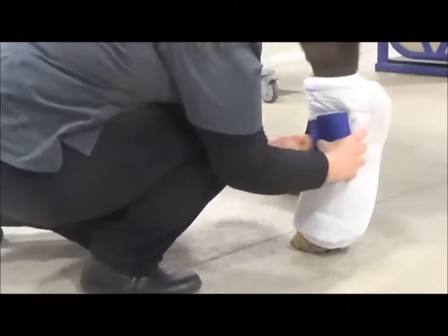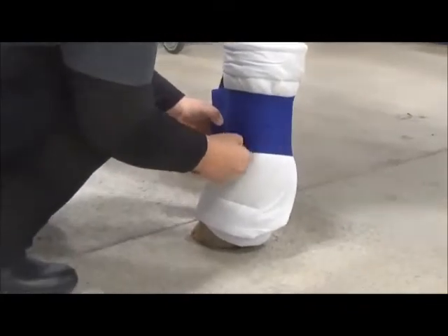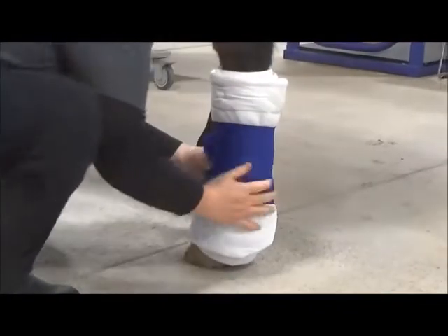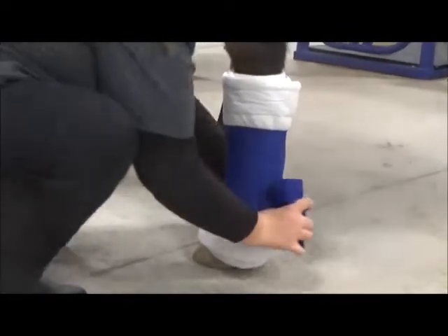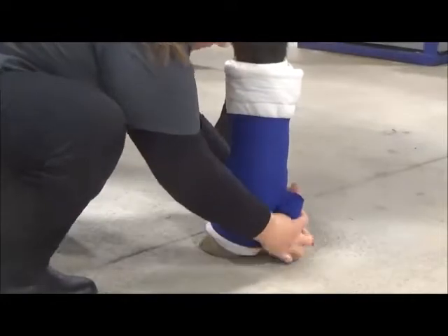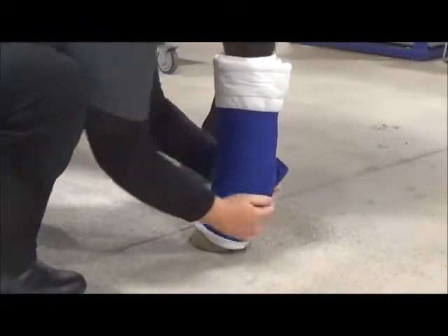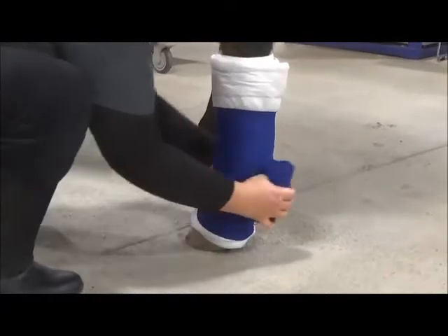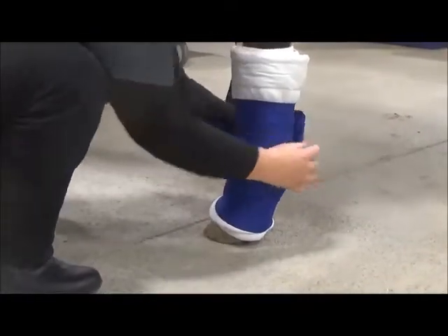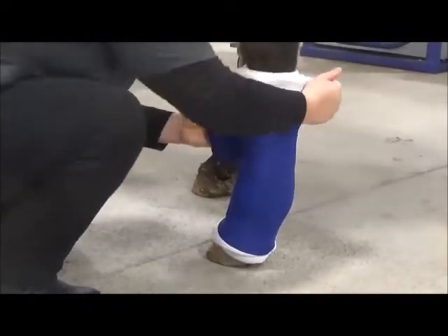And again, these pillow wraps are really, really thick, so I can put a lot of tension on them. And a little grunting is good. I'm gonna still leave a little bit of wrap at the bottom, like I did before for the front leg. And that just prevents the bandage from binding on itself if it were to get below the padding.